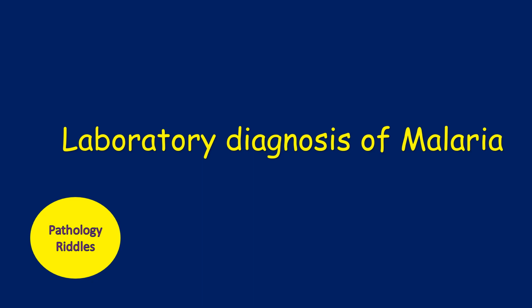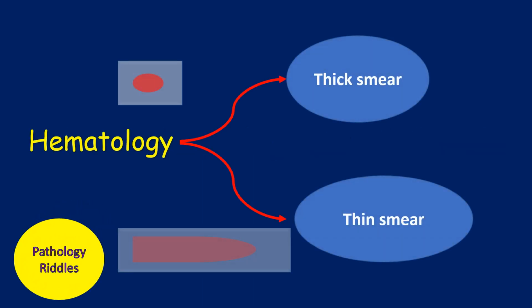In the previous episode, we discussed the etiology, life cycle, pathogenesis, and clinical features of malaria. Today, we will discuss the laboratory diagnosis of malaria. In hematology, we diagnose malaria using thick and thin smears.